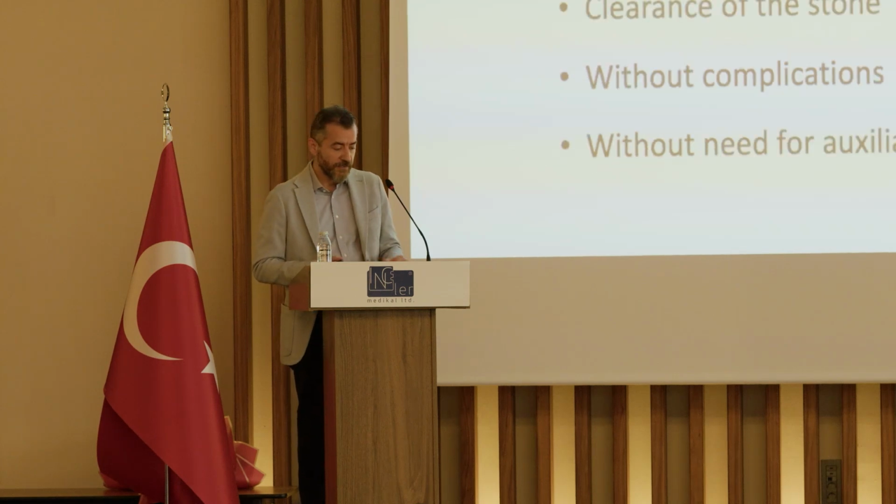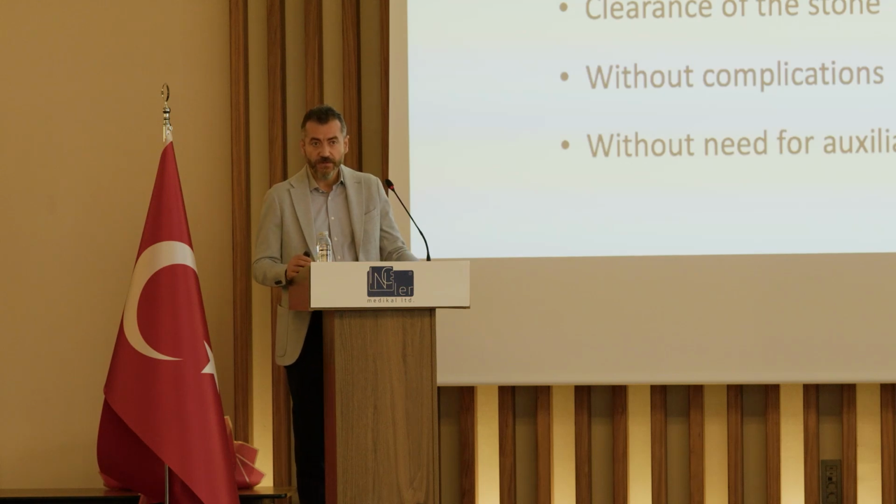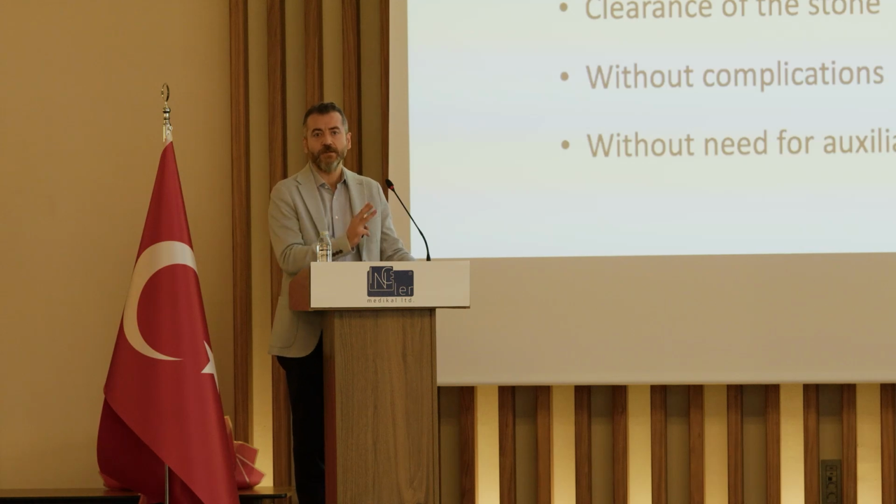And as I mentioned, the reimbursement and insurance is very important for our selection of the procedure for our individual patient. For instance, in our social security system, for shockwave, we are allowed to do just 3 sessions in 6 months for each side of the kidney.